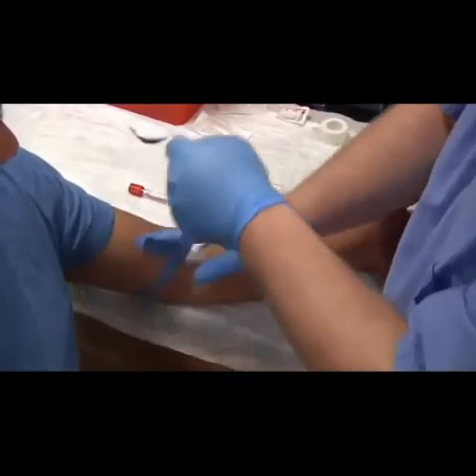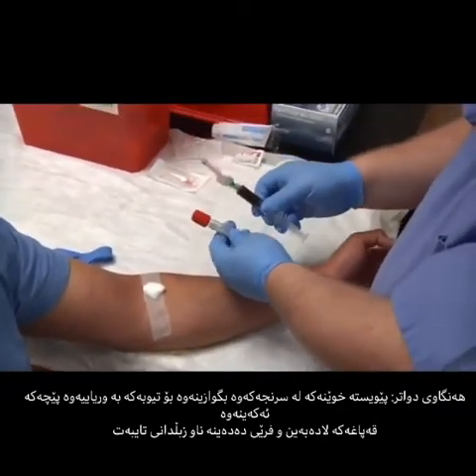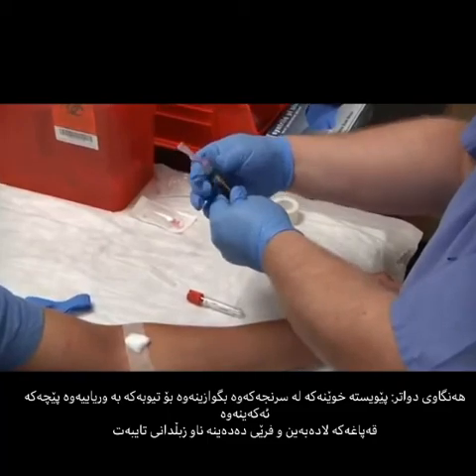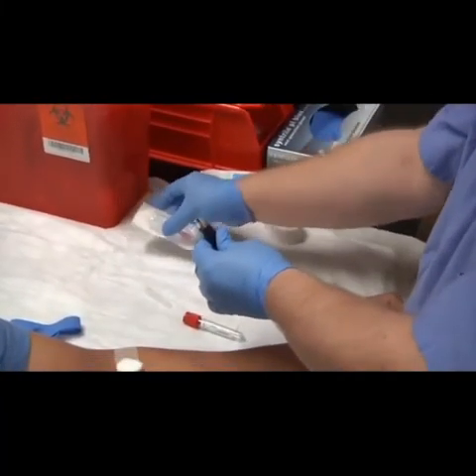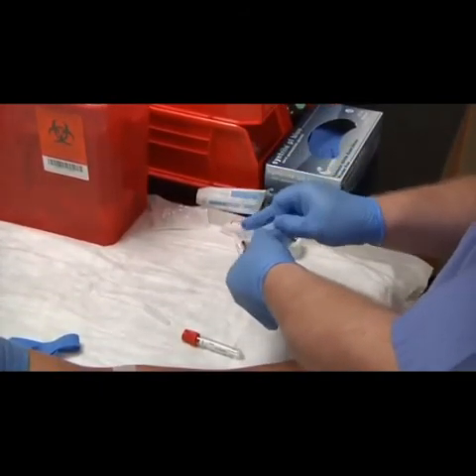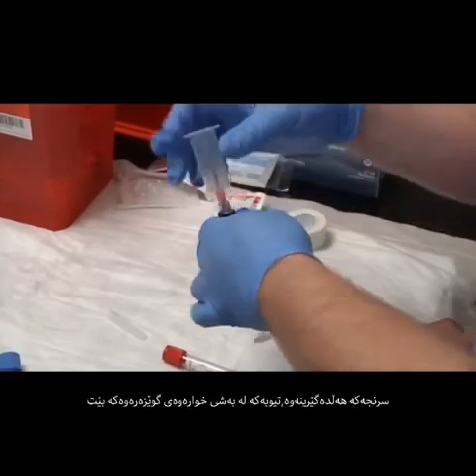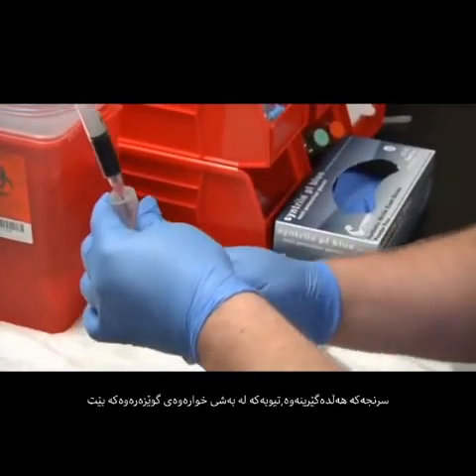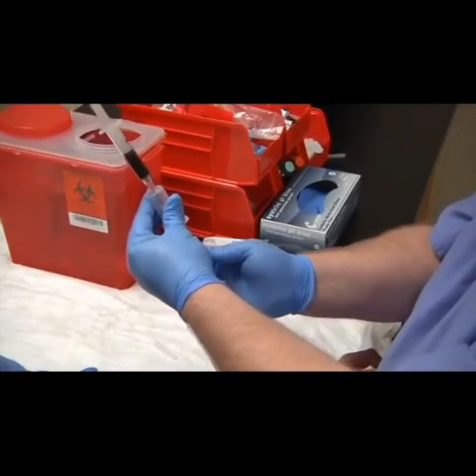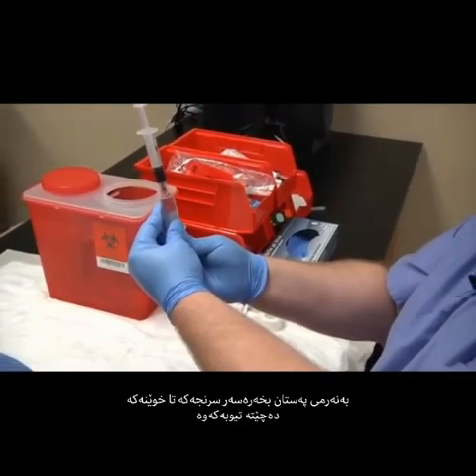We have our patient bandaged. Now the next step — since we drew this into a syringe, we need to move it from the syringe into the evacuated tube. Very carefully, unscrew the safety cap needle and dispose of it in the biohazard. You'll need your transfer device — make sure it is in date. Attach your transfer device; it screws in just like the needle. Turn your syringe upright and insert your tube from the bottom. Make sure you face your label away so you can see when the tube is done collecting. Gently press in and let the vacuum do the work for you.